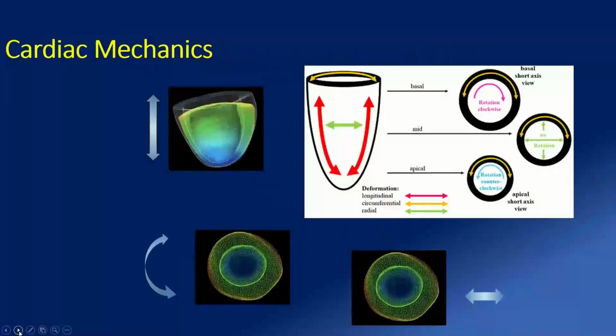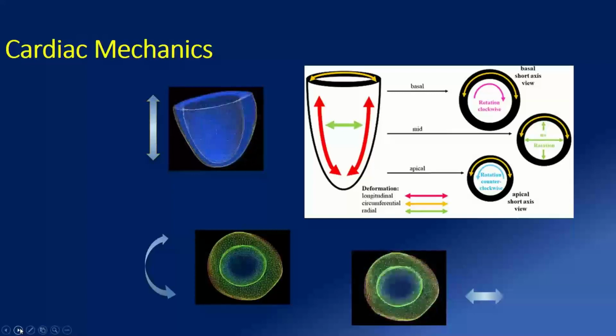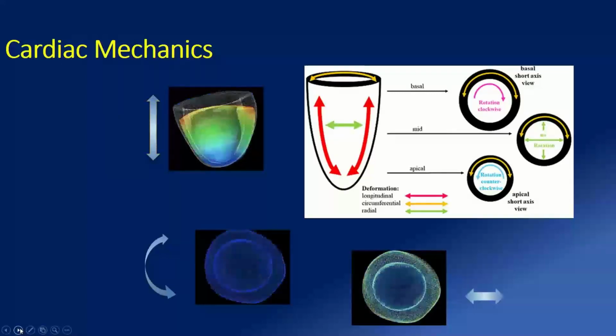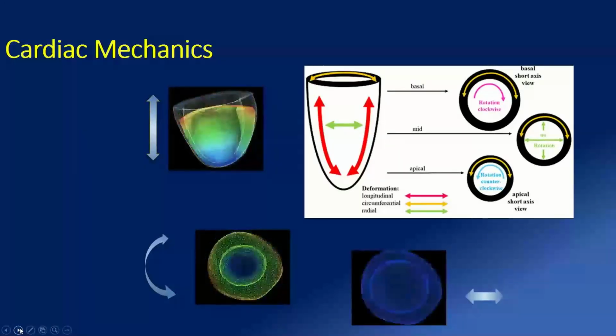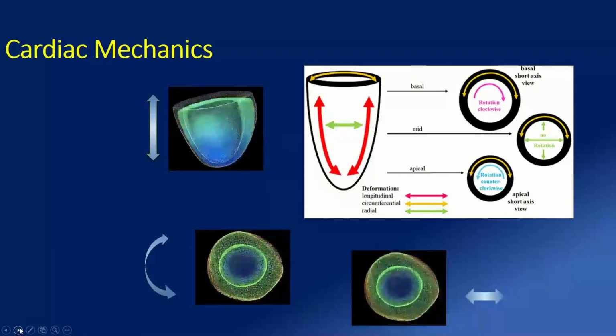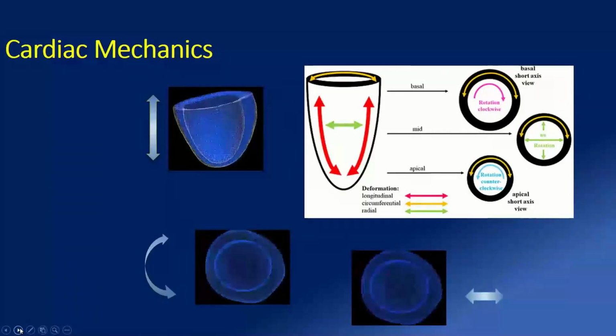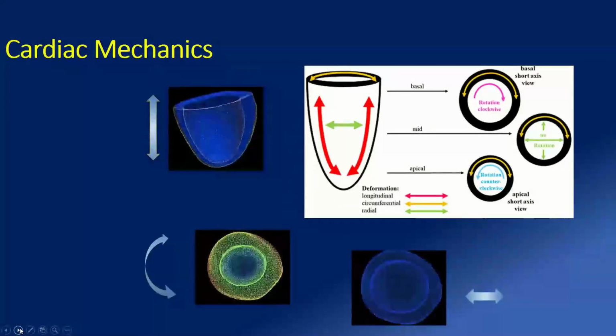But of course, the assessment of our patient's morphology is important, but we need to also assess function. And we know that cardiac mechanics is rather complex. It's much more complex than ejection fraction. We all talk about ejection fraction, a very convenient parameter. Everybody knows about ejection fraction. It's a very easily understandable parameter, also across different specialties, but it probably won't tell the whole story.